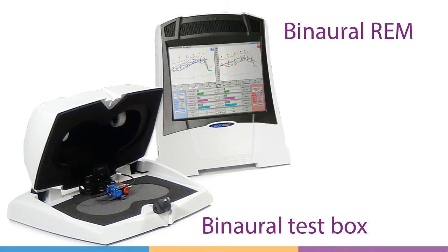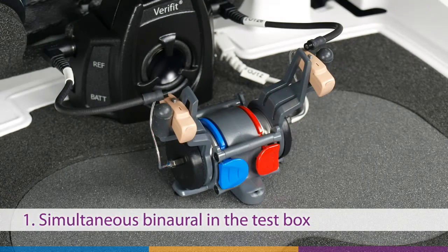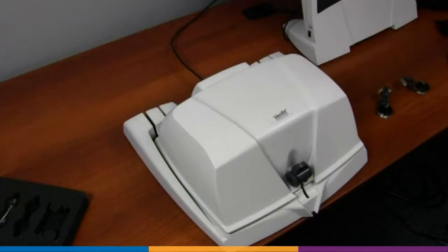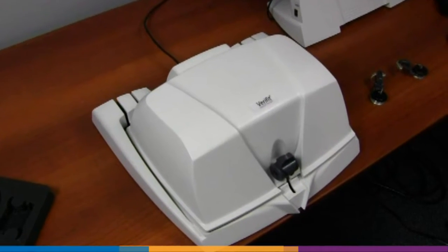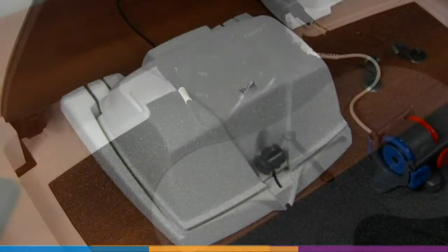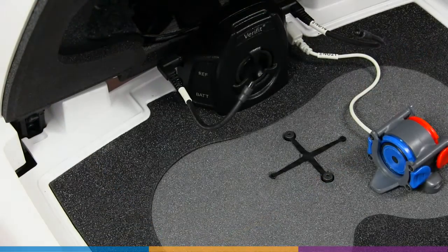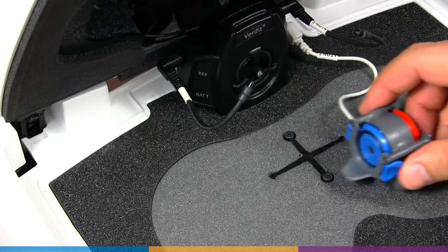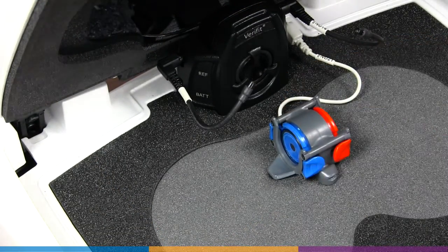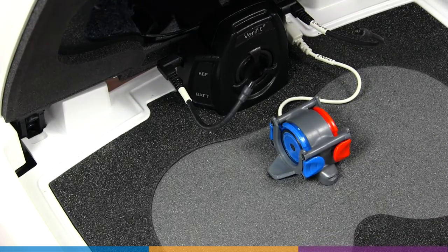The Verifit2 test box features two microphone sets and the ability to couple instruments in pairs. As the binaural coupler microphone is self-centering within the near field of the sound source and contained within an acoustically treated test box, a symmetrical sound field is easy to provide.